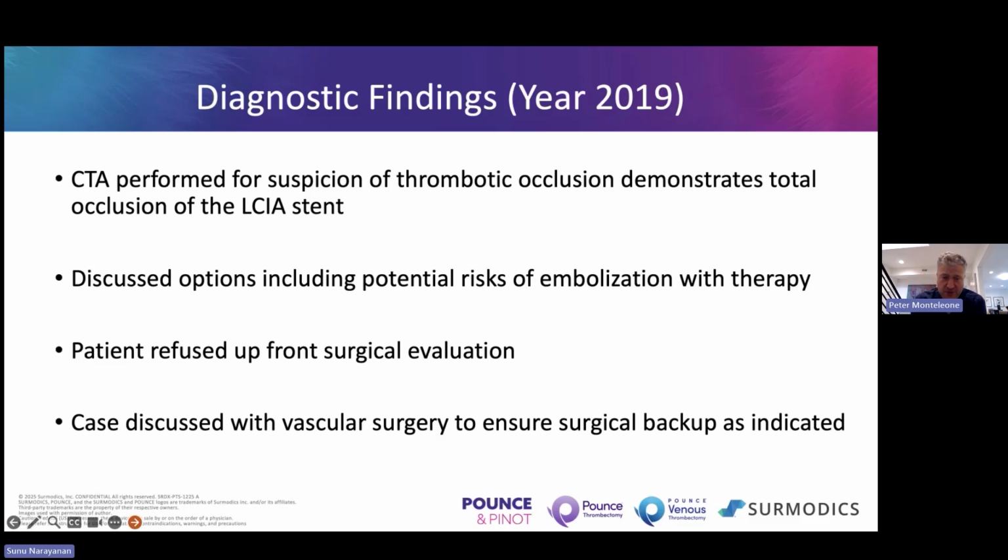And historically, as a non-surgeon, as an interventional cardiologist, we always made sure that the option was there for doing open cutdowns and balloon thrombectomies on these cases to try to prevent those catastrophic outcomes. I actually talked with one of my vascular surgery buddies, and said, if we're not going to do vascular surgery, it's kind of a high risk surgical patient, at least we have surgical backup around in case things did go south. Next slide.